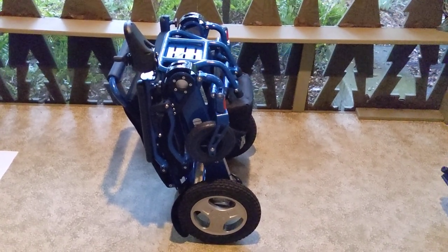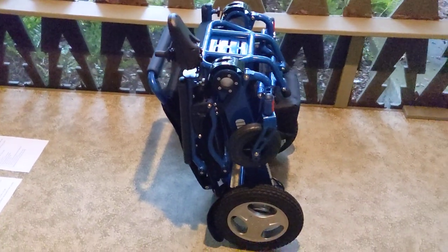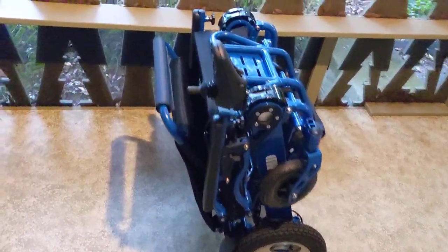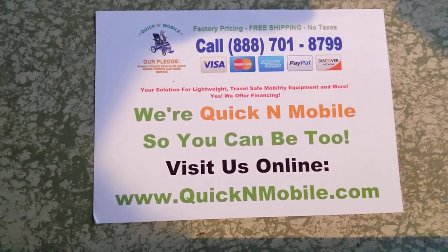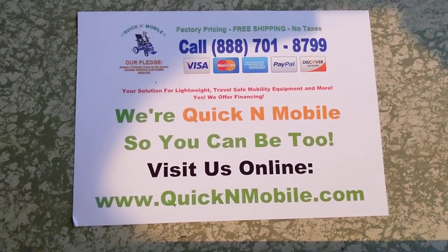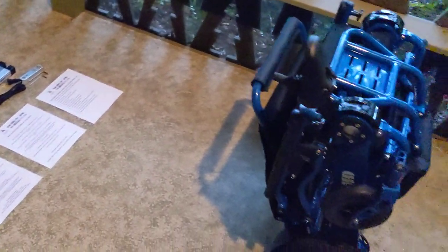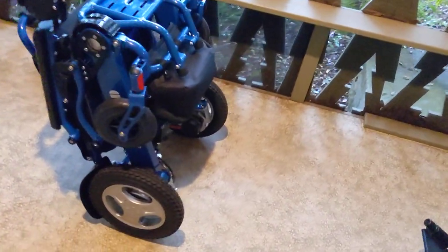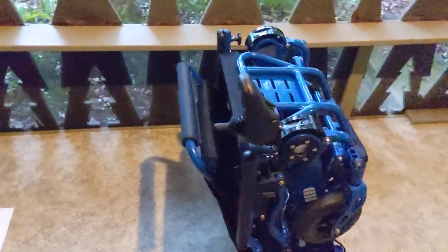Hello, this is Paul from QuickenMobile.com, and today we're going to be doing a 2021 review of the Eagle Power Folding Wheelchair. I'll give you an opportunity to go ahead and pause the video so you can write down where to find us online before we get into things. As you can see, we have a few things laid out. We're going to go over updates on the Eagle, specifications, capabilities, what the chair can do, what the chair can't do, and how the chair functions.